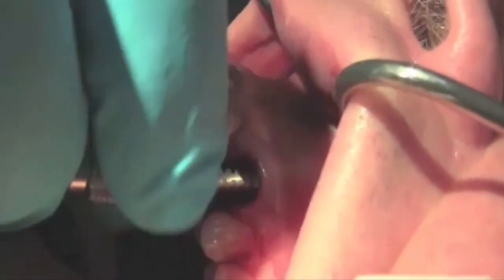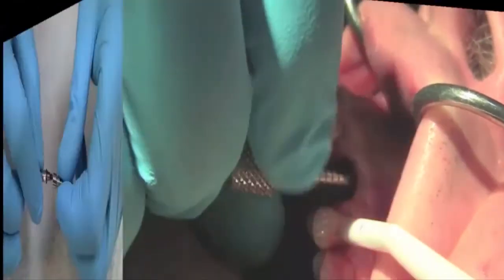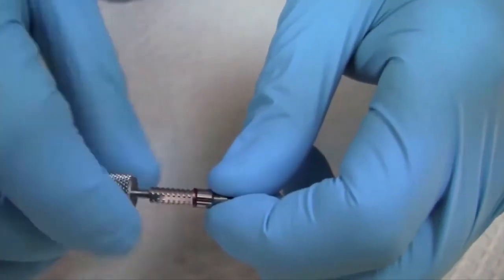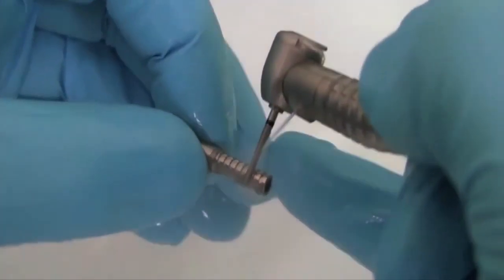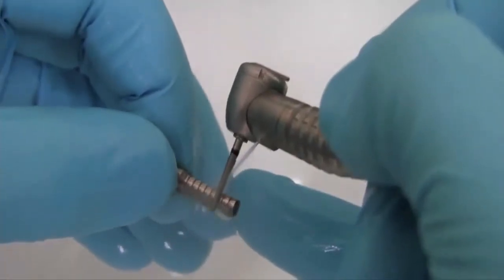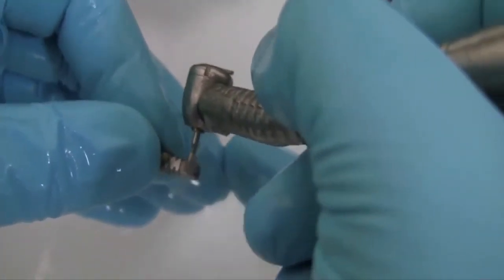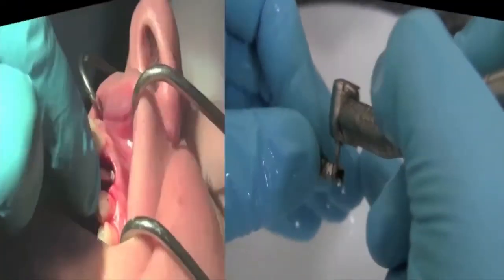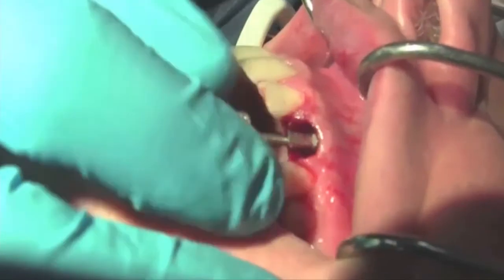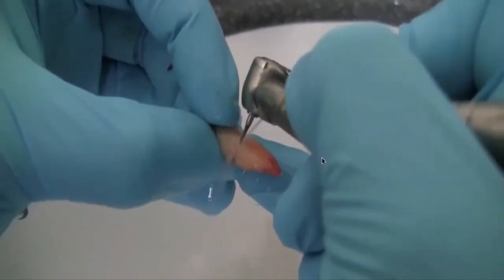We remount the abutment into the analog, and with a burr we trim it to obtain the right distance. This is a regular crown preparation burr, and this is a football burr to improve the dimensions of the abutment in reference to the occlusal clearance. You can see the flat, in this case, well positioned.